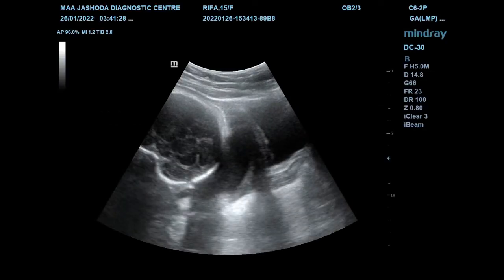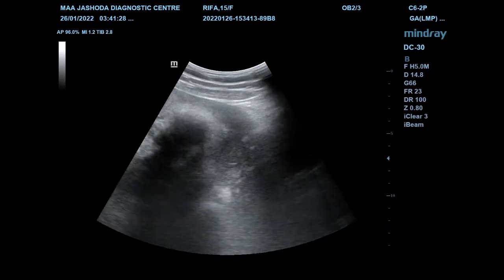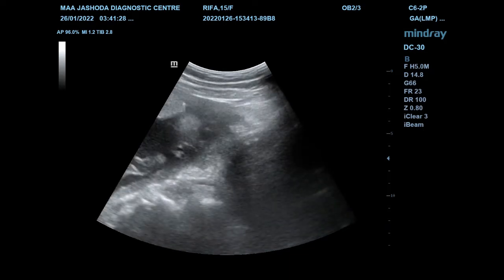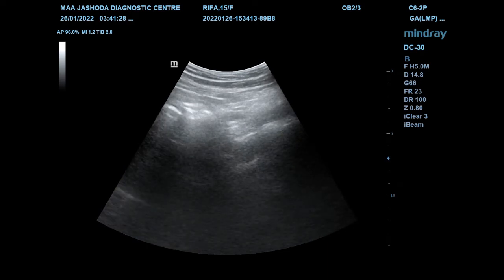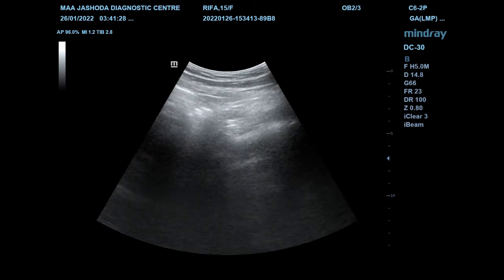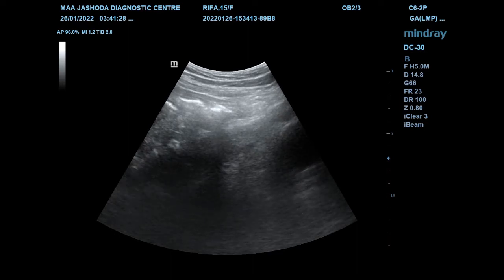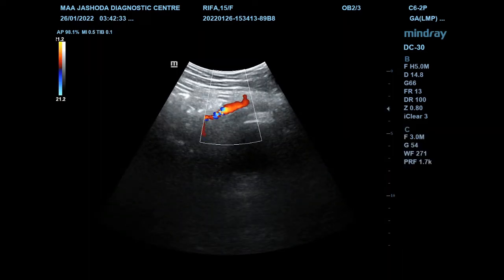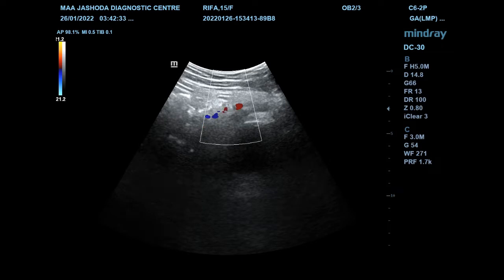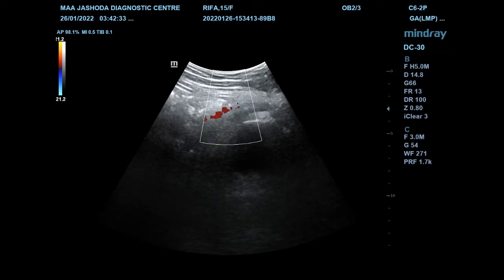Sometimes it may be difficult to identify the uterine artery in late pregnancy, but I think it is a very easy process to trace it. First, place the probe on the midline in the suprapubic region, then slightly move the probe to the left iliac fossa, tilting towards the right.